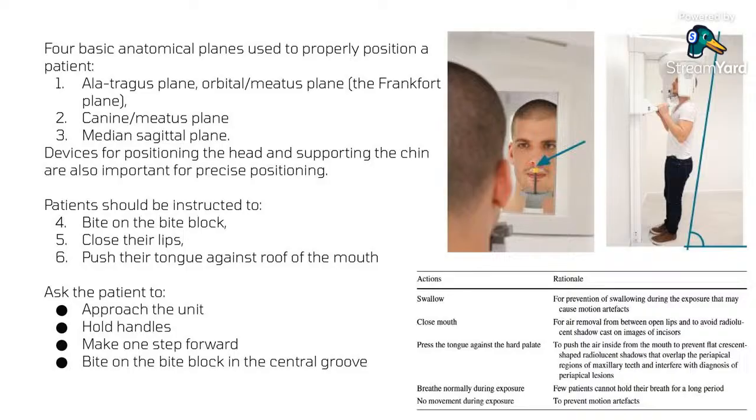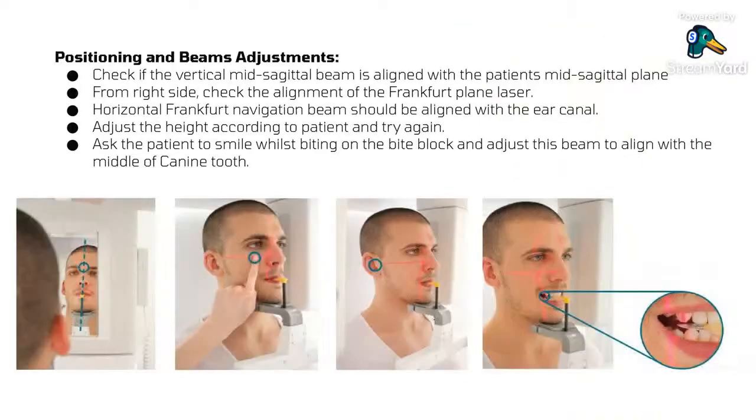So why would you want to ask the patient to put their tongue to the palate? It's a very basic concept. You can read the table. We don't have that much time that I would go into every single detail. I'm just going to stick with the technique.